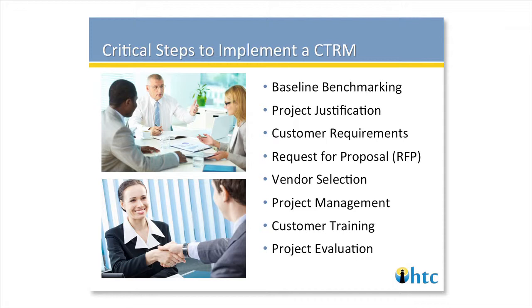Once you select that vendor, then there will be some project management involved. The vendor may supply some of that, but generally speaking, there's also a project management staff that's on site as well, because you have both what the vendor's doing, but there's usually activities that need to happen on site as well. So I've seen very often that there will be a project manager from the vendor and one from the client as well. Once the project is implemented, and there may be some fine-tuning as the project is implemented, you'll want to have training, and that training would be both on the new system, but there may also be some workflow changes that are happening, and so you'll want to train on that as well.